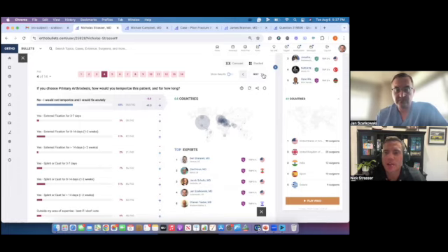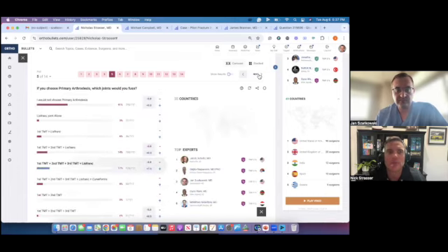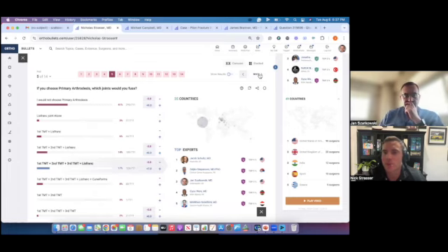And in that case, I think the question would be interesting of where are you going to put your pins? Because whatever approach you decide to use, where you put your pins can matter in terms of where you put your incisions. That's something I kind of wrestle with a little bit. I have my standard approaches, so I think I know where I'd want to go. Ideally put your pins outside that plane. Do you definitely bury your pins? Do you bury them?